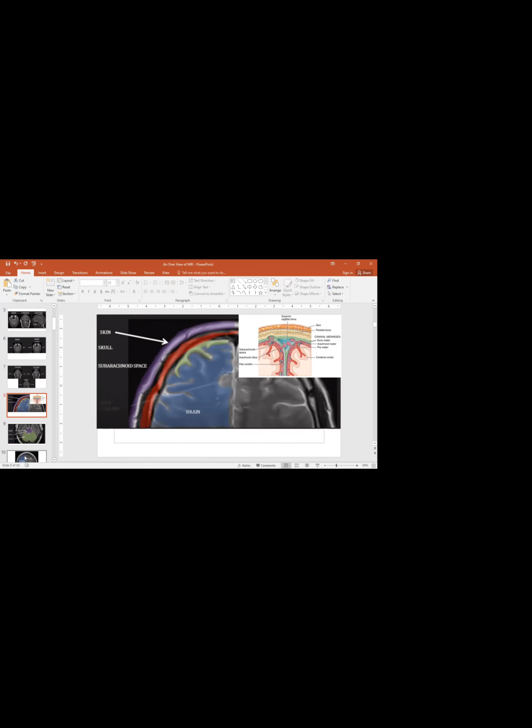Then coming to our studies, what structures do we generally see in the fetal skull, the adult skull, and the adult brain? MRI of the brain is commonly done and is requested many a time. The request for MRI of brain and MRI of skull is usually much in demand. To start with, how do we identify the structures of the skull on MRI?